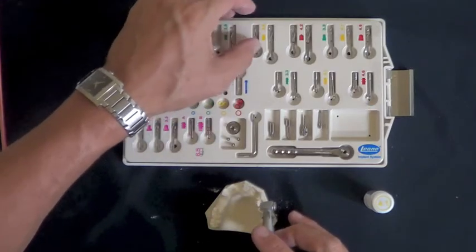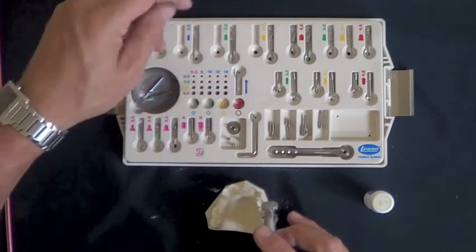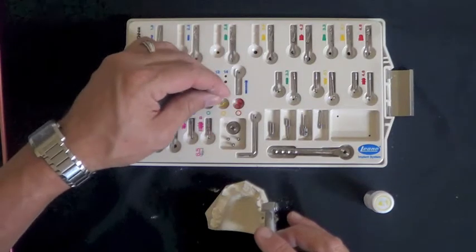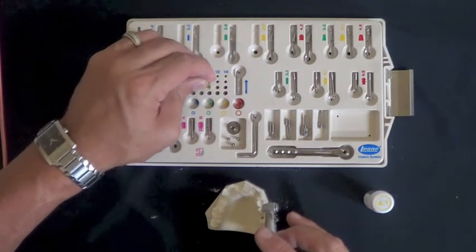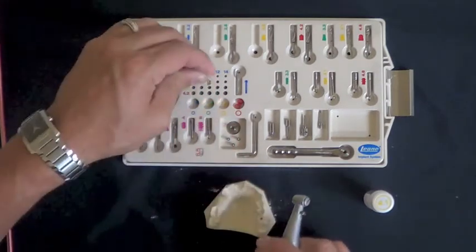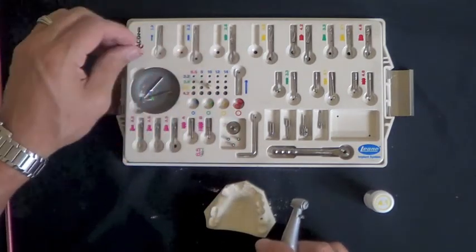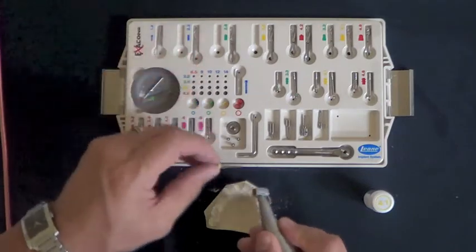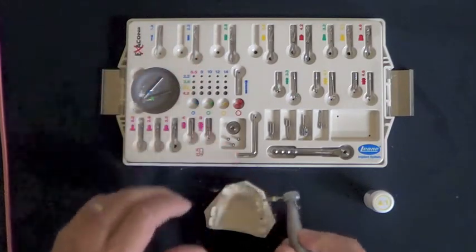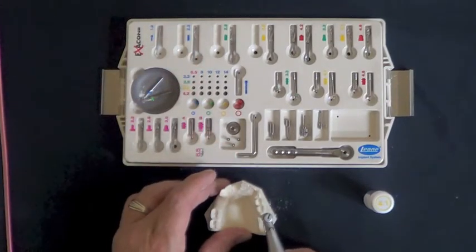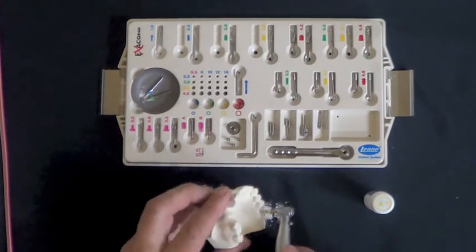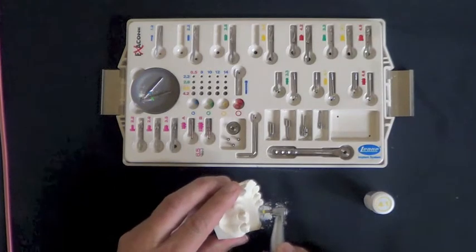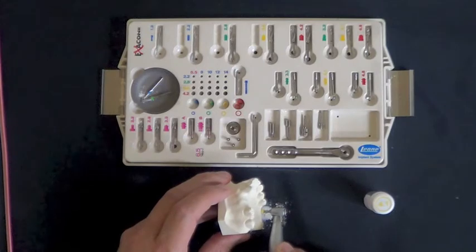And the final drill then would be for the 4.1 implant, the 3.5 millimeter diameter drill. Again the ringlet on the drill, place it in the 10 millimeter length depth indicator on the drill, and then again take this down to the length of the osteotomy. So there we're set at length.